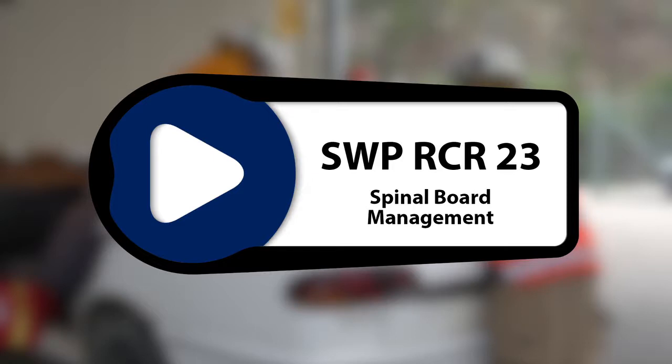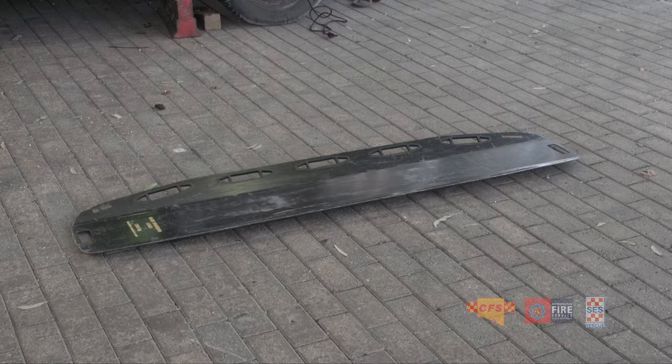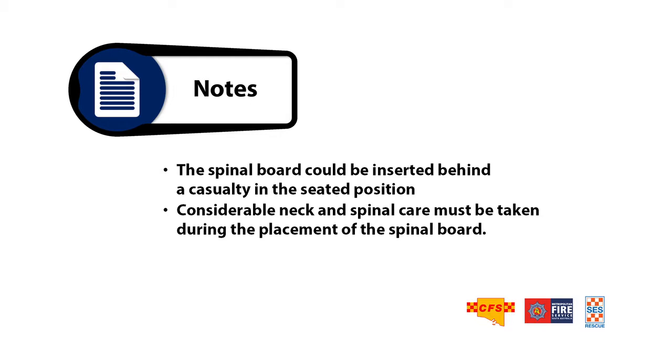The following stages and procedures are for spinal board management. Stage 1 is locating the spinal board. Prior to extrication from a vehicle, a spinal board will be required to be located for the casualty to be placed on. The spinal board could be inserted behind a casualty in the seated position.